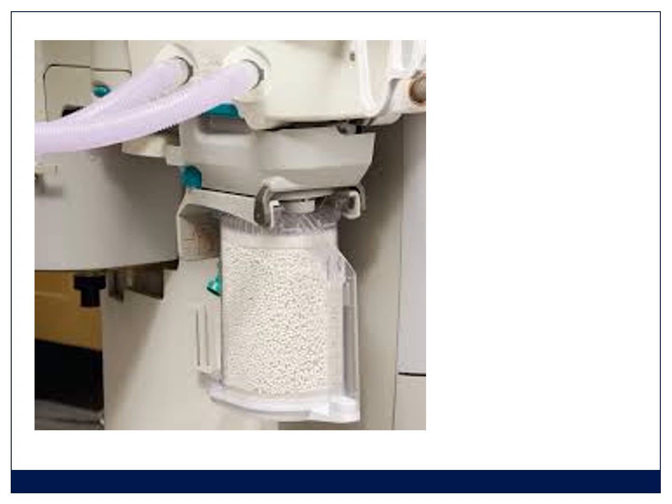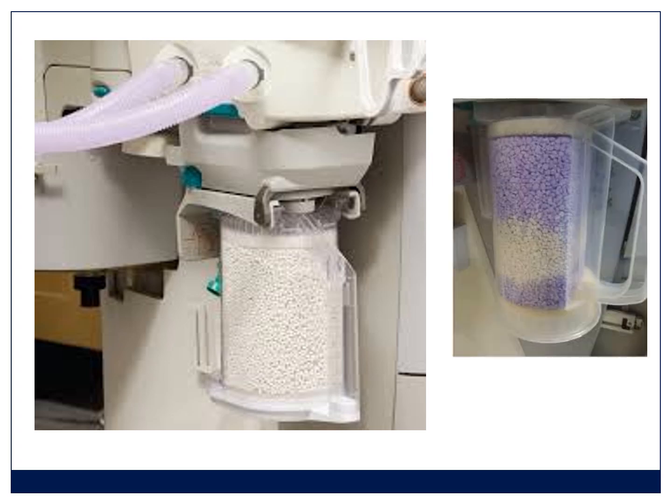There should ideally be less than 50% color change at the start of an anesthetic, which tells you about absorber saturation. Now, you can actually use these for longer than that, but you need to be very confident then that you can change soda lime in the middle of a case. Remember that you can do it. It seals off the circuit, but if you're not sure, rather just change the soda lime. When it starts to get used, it changes color to purple, like that.